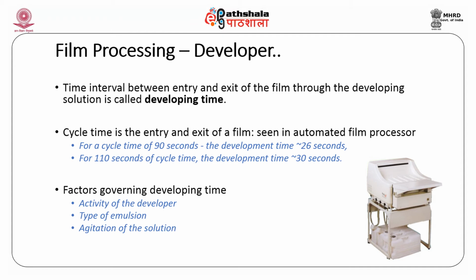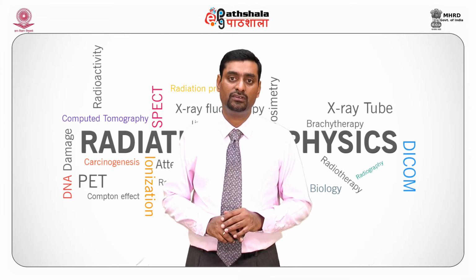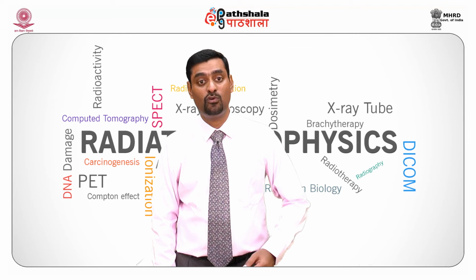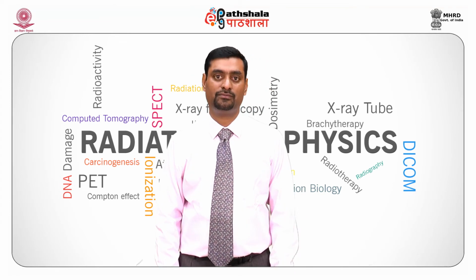What are the factors that govern development time? That is, one is activity of the developer, type of emulsion and agitation of the solution. These are the factors that govern how good the film is going to be developed. Next, we move on to a film processor, which is the fixing.